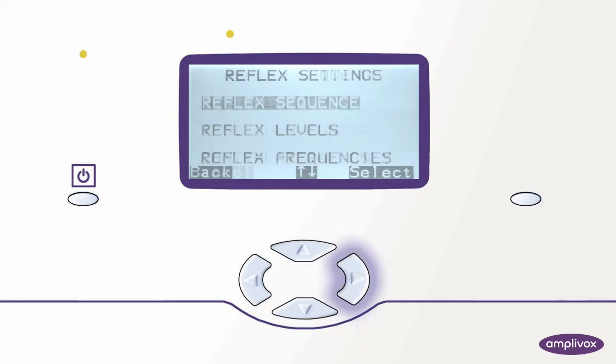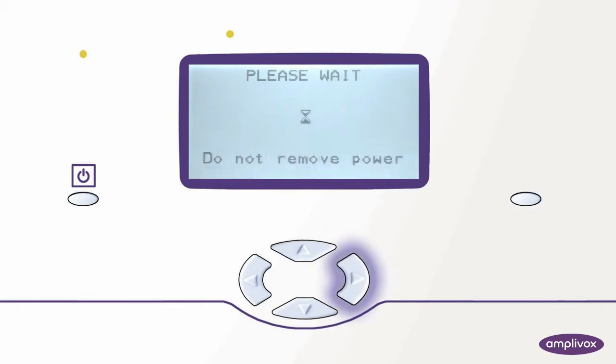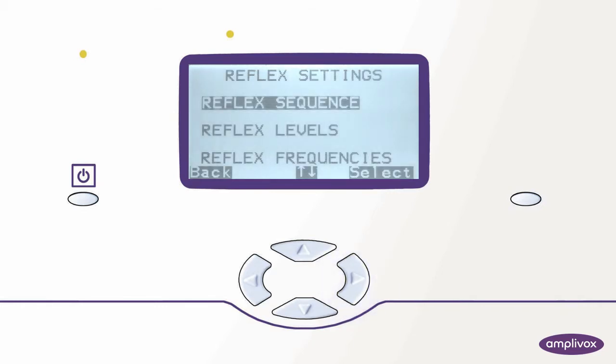The first thing we would like to do is to set the reflex sequence. We are offered three different options on how to run a reflex test. For now we would only like to perform ipsilateral only testing so this is what we select. After confirming our selections we will be brought back to the main menu of the reflex settings.